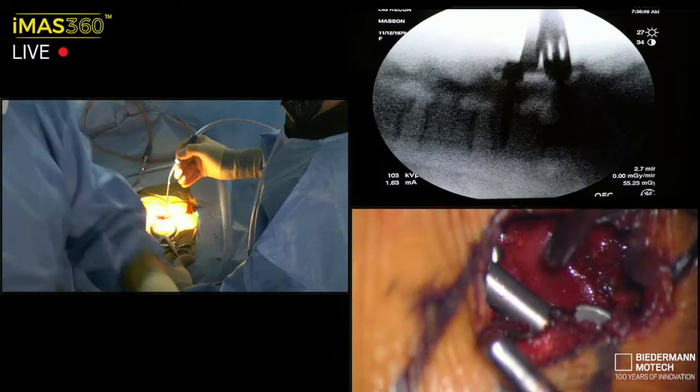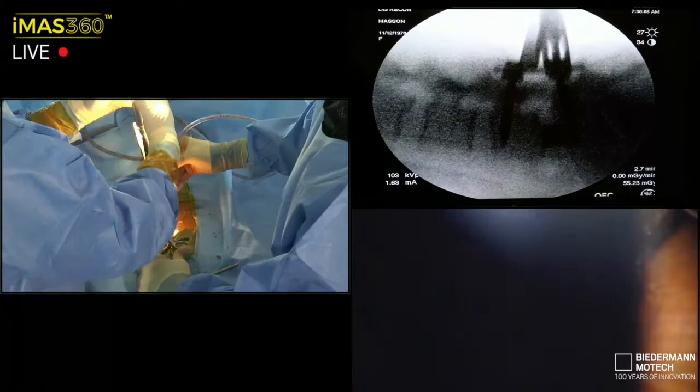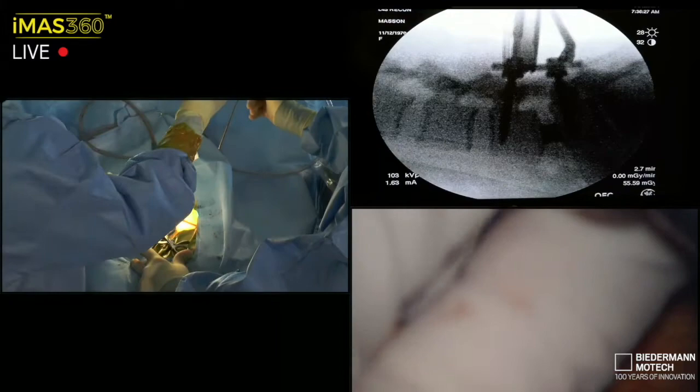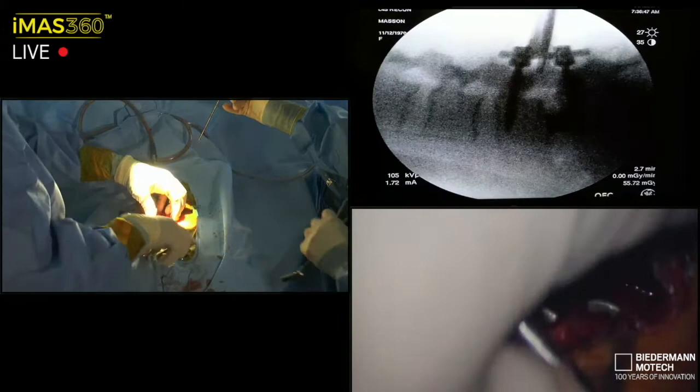So this is the chopstick compressor. It goes on the rod under the top head, bringing the driver through it directly in, and then loosen the top, gentle squeeze, and close, and tighten. Let me secure it, make sure that's completely tight. Okay, we're good. That's left 4-5. All right, let's go right.